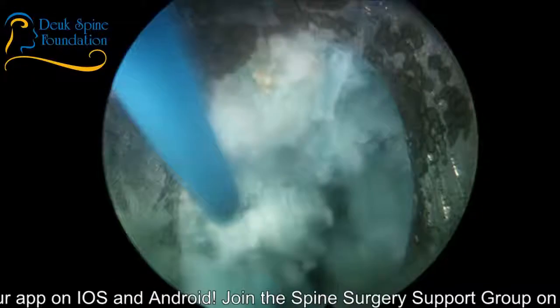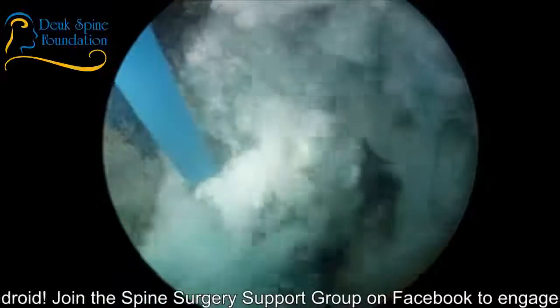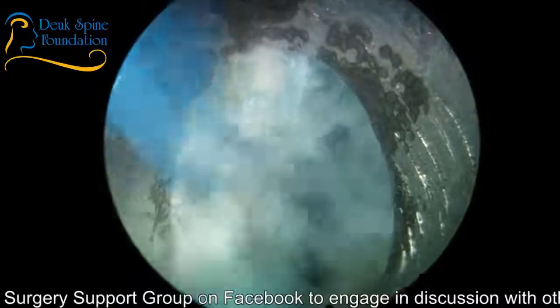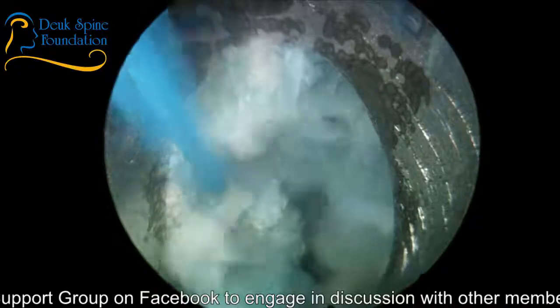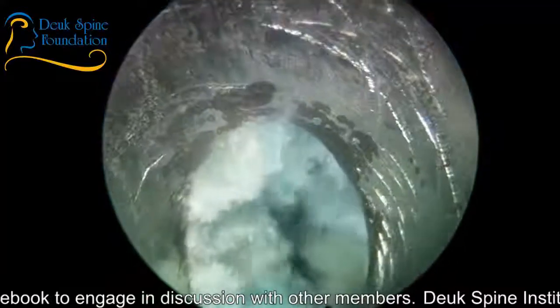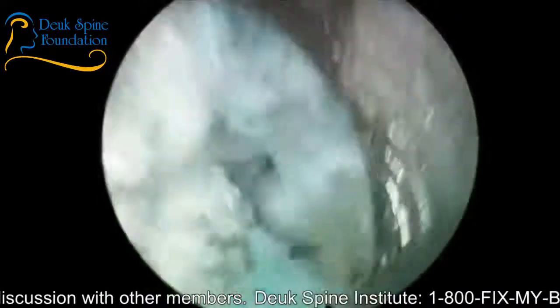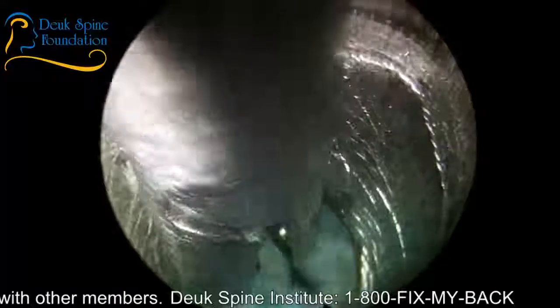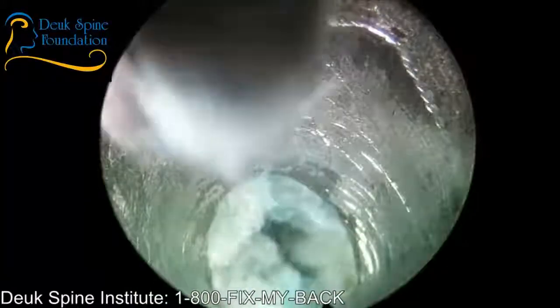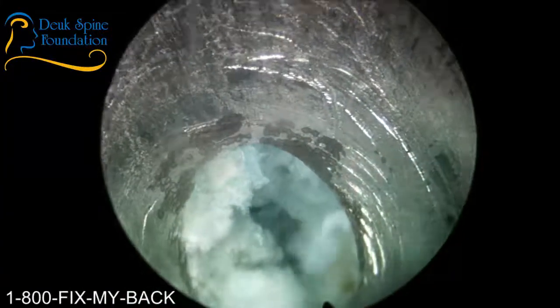So it didn't work. And you see all this white stuff in here? This is all from an epidural he must have had. That's particulate matter. A lot of doctors use cheap medication like depomedrol. Patel doesn't use depomedrol for epidurals, does he? No, because it has that particulate matter in it. It's like an impurity, but the reason they use it is because it's cheap. Not us. We don't use it because it's not supposed to be used in the spine like that, because it has that impurity. And the impurity causes scarring.